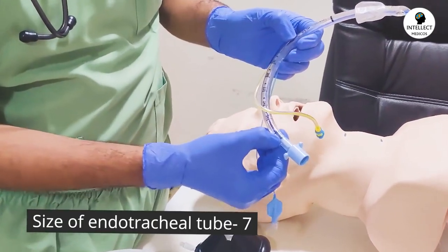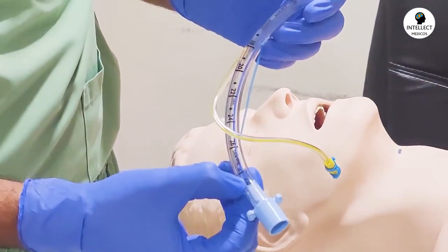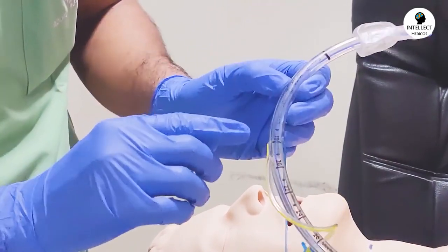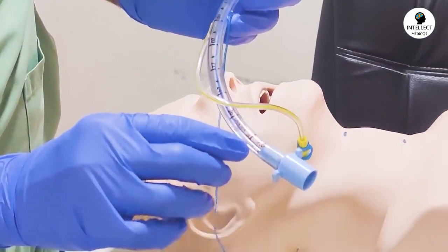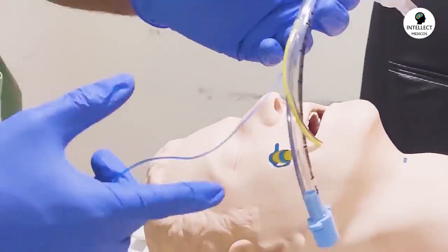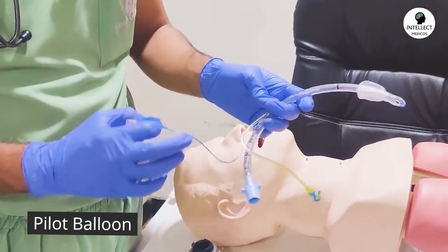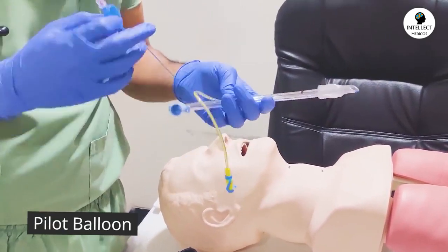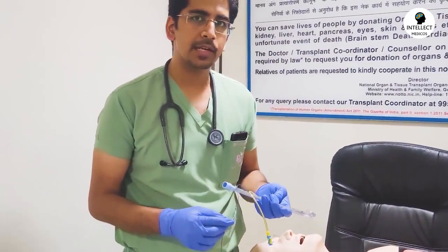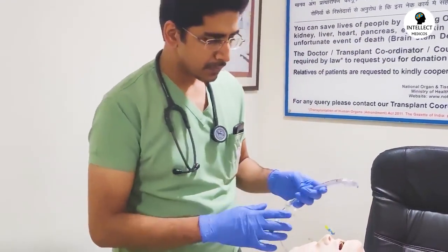And this 7.0 suggests the size of the endotracheal tube is 7, right? That is the internal diameter. It is written over here as ID 7.0. And starting from 18, it goes till 26 centimeters and 28 centimeters. This is called the pilot balloon. From here, you can inflate the cuff. In an adult population, we try to intubate a patient with a cuffed endotracheal tube so as to prevent any kind of aspiration, right?